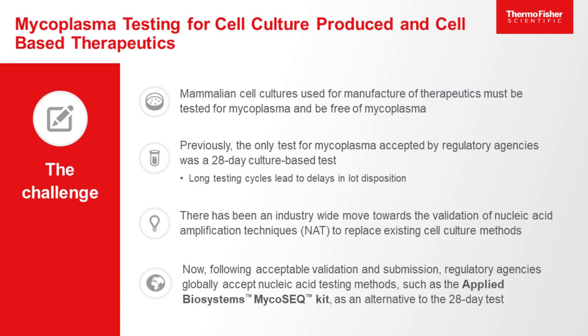Thank you, Chantelle, for the introduction. So, mycoplasma is a known contaminant in mammalian cell culture and can affect the safety, quality, and efficacy of biotherapeutic products. Because of this, it is a regulatory requirement to demonstrate that cell culture-based therapeutics are free from mycoplasma.